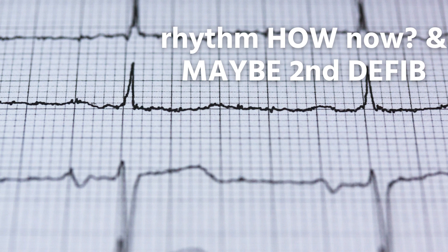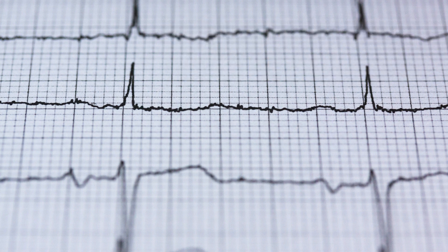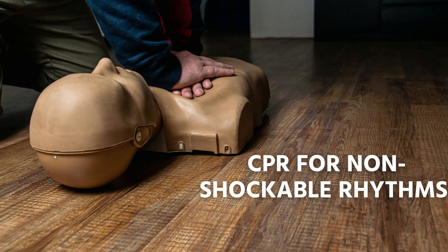If not, the defibrillator will tell you to press the button again for a second defibrillation. Remember: the defibrillator will tell you to continue external chest compressions if the heart rhythm is not shockable after AED analysis. So restart the external chest compressions immediately. Do not shock.